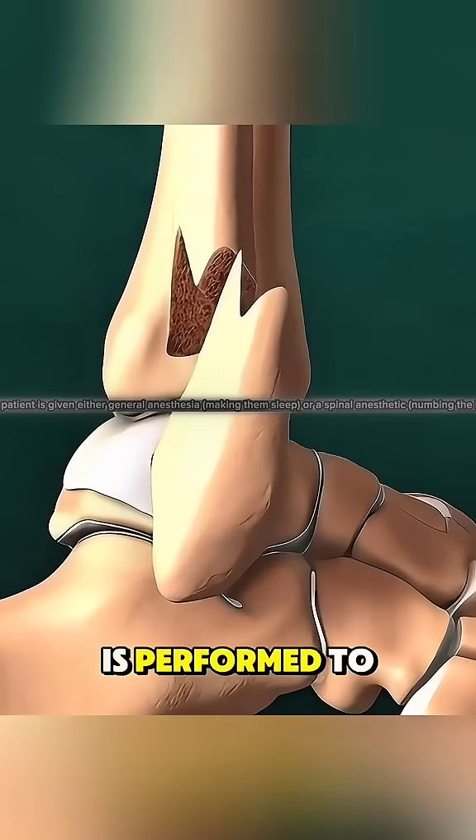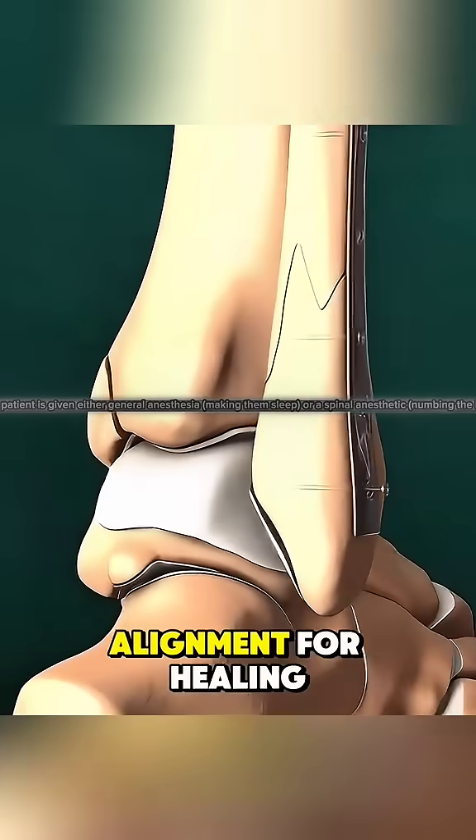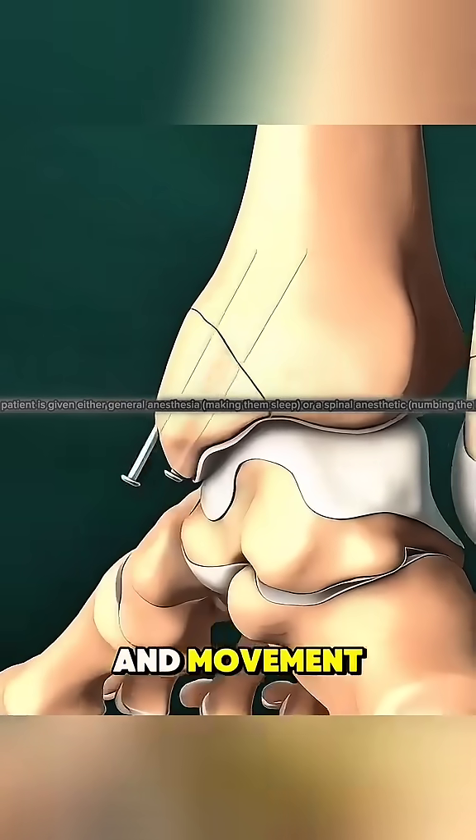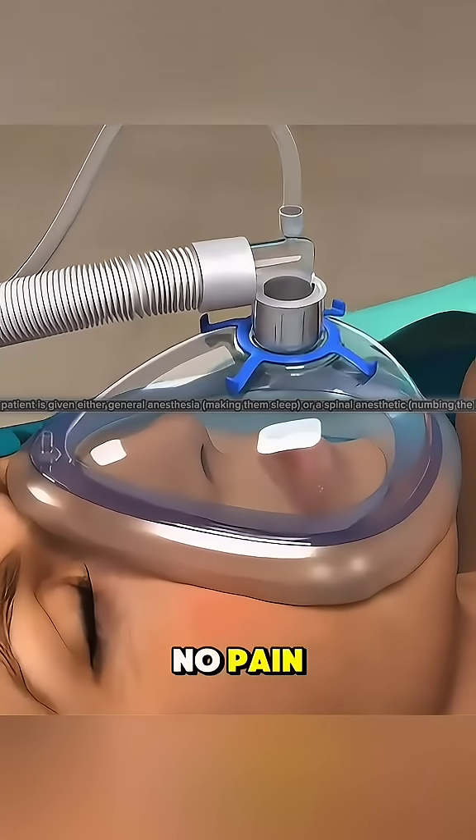Ankle fracture surgery is performed to repair broken bones in the ankle and restore proper alignment for healing and movement. The procedure starts under general anesthesia so you feel no pain.